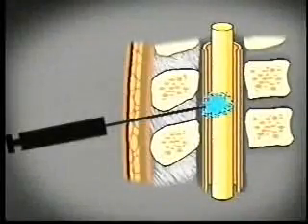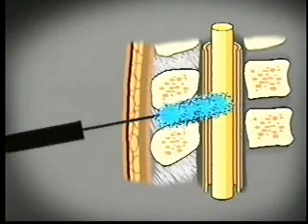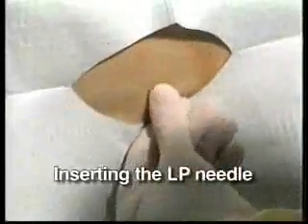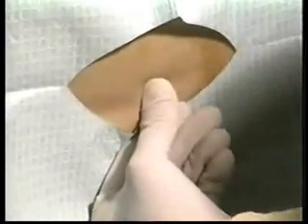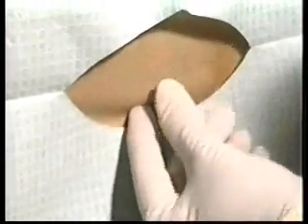When numbing with lidocaine, place the needle all the way in, then slowly back out while infusing. Since the patient feels pain on insertion, this works better than making many small thrusts, numbing as you go. After numbing, recheck your landmarks. Place your hand at the bottom of the spinous process. Mentally note this spot. You want to enter here.